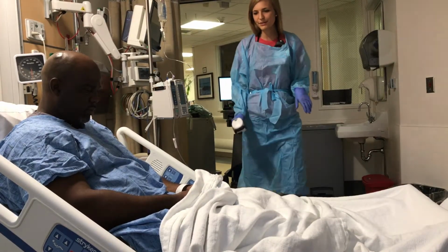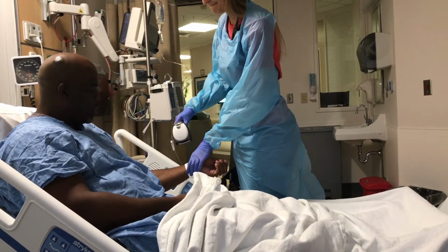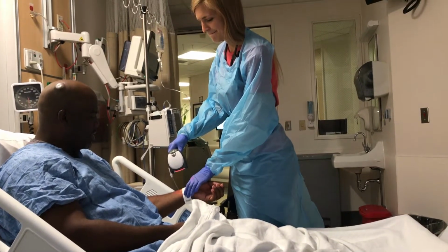What's your name and birthday? It's Mr. Holiday. Date of birth is February 22nd, 1976.